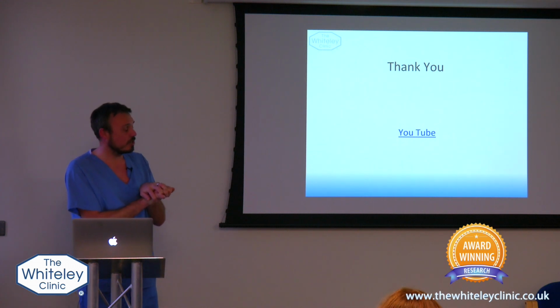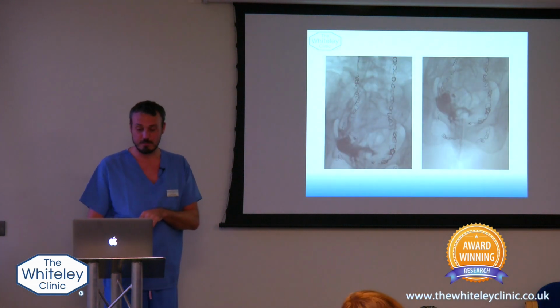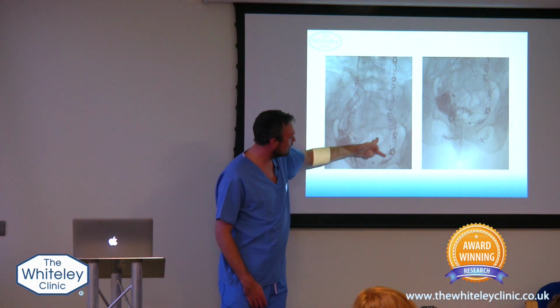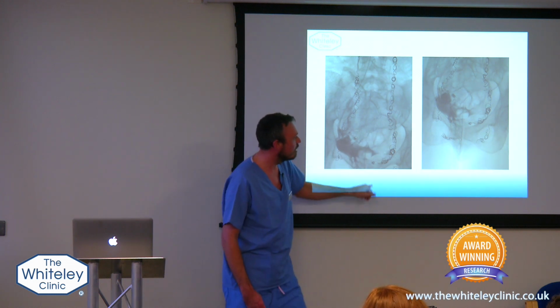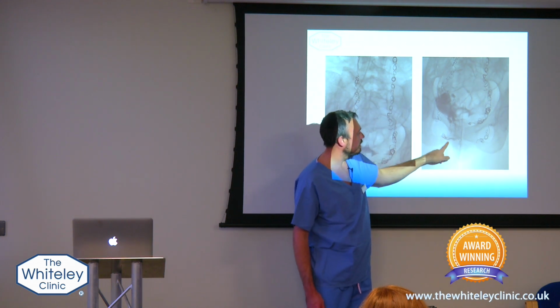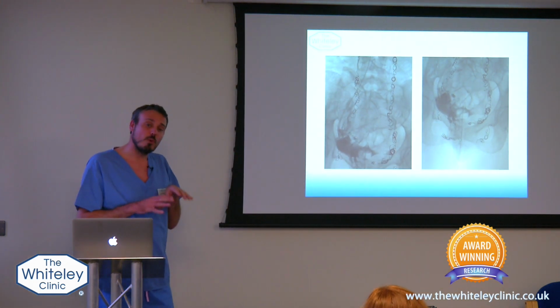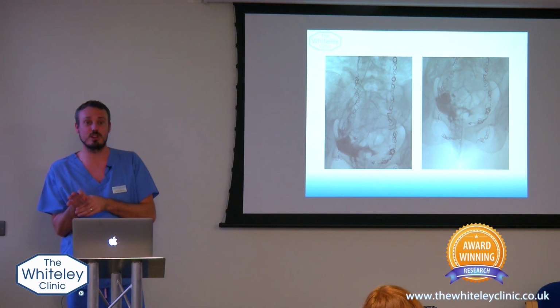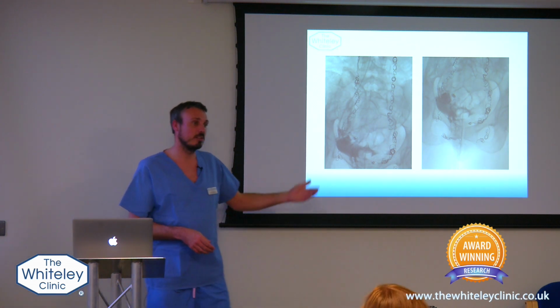The other thing, in terms of your earlier question about how deep we can get into the veins, for example, on this case here, we're treating this vein, this pudendal vein here. Now we know, just like on this side, the veins go further down. They've gone into the vulval area, the vaginal area. But I've only got one coil deep here. I'm not getting coils any deeper on that side. So what you can do, once you've got your catheter in place, is use the same Valsalva manoeuvre for the transvaginal scan, and you can inject the foam sclerotherapy. And what that will... Sorry?